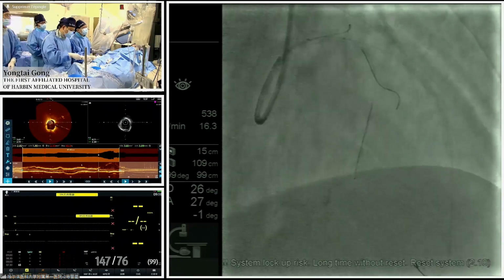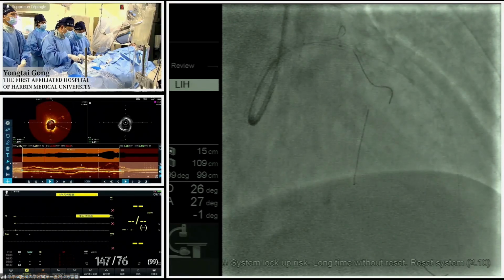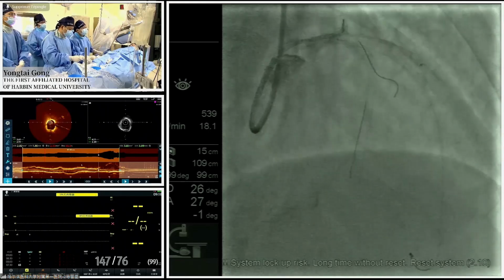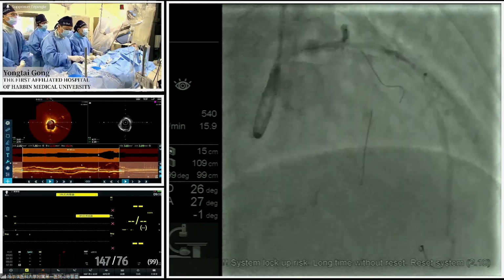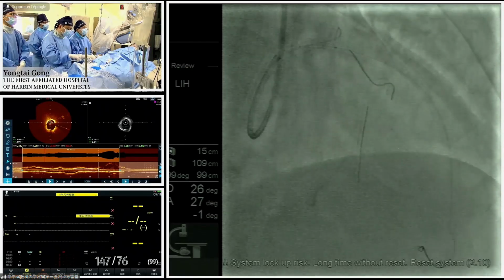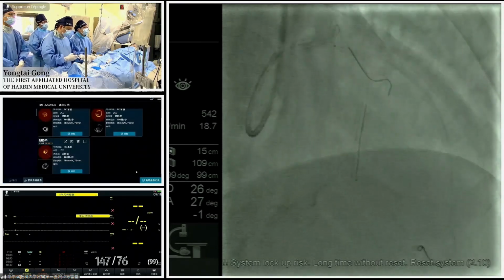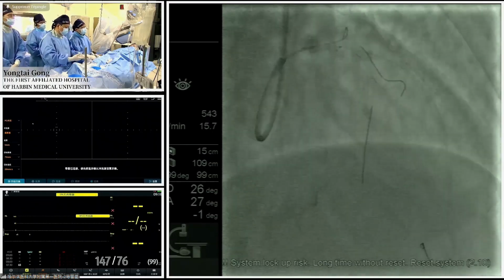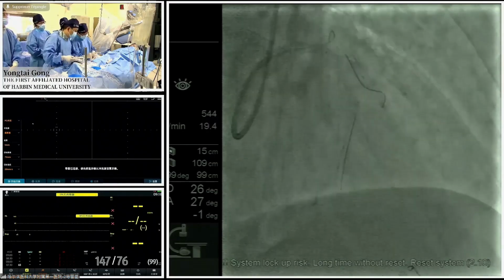The main branch stent is pulled back against the inflated balloon. The stent is then deployed, and then the balloon removed thereafter. The double kiss technique can also be used. Actually, there are so many techniques that could be used to treat a lesion like this one.